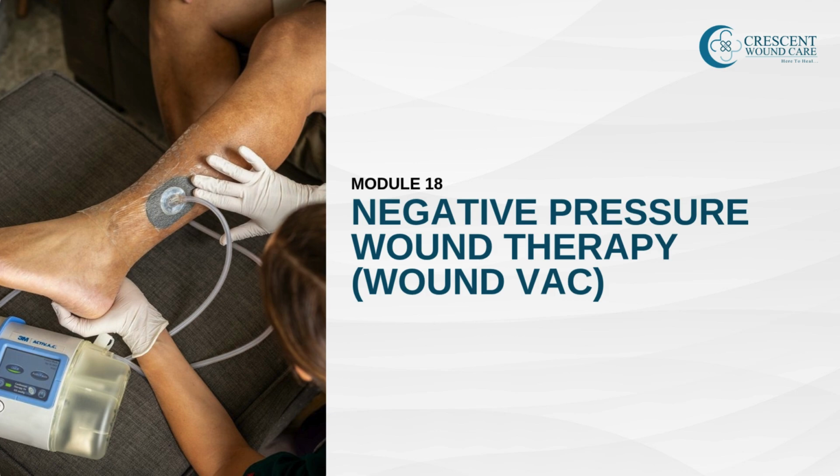Welcome to Module 18, focusing on negative pressure wound therapy, also known as wound vac. This advanced wound care modality has revolutionized the management of complex wounds. Through the use of controlled, localized negative pressure, this therapy helps stimulate wound healing, reduce infection risks, and improve patient outcomes. Whether you're applying NPWT in a hospital, long-term care setting, or the patient's home, your knowledge and skill as a nurse are critical to ensuring success.